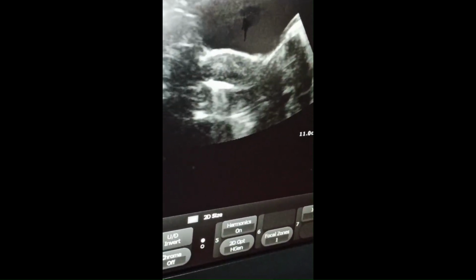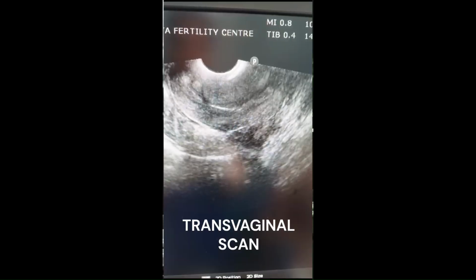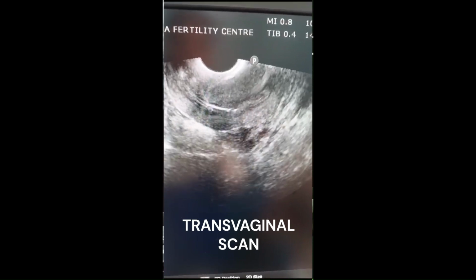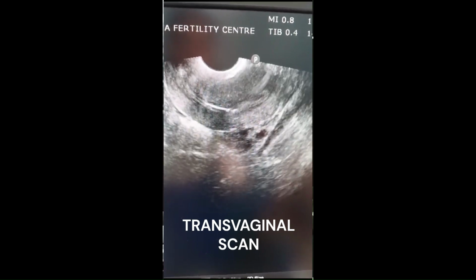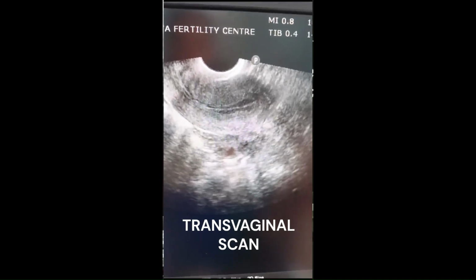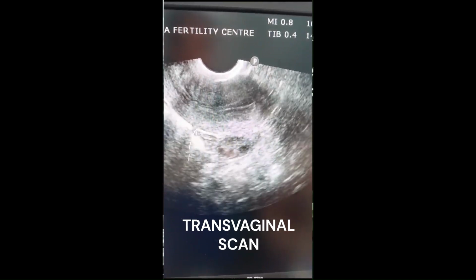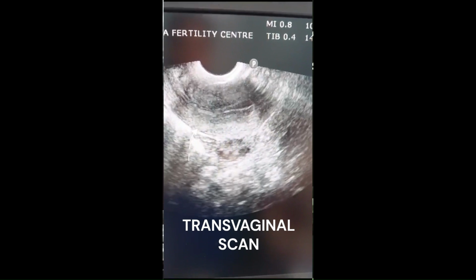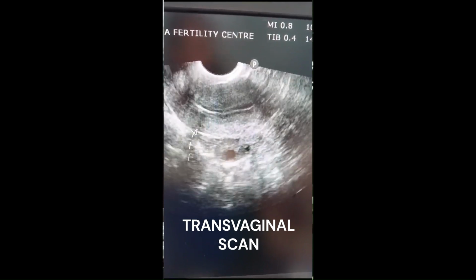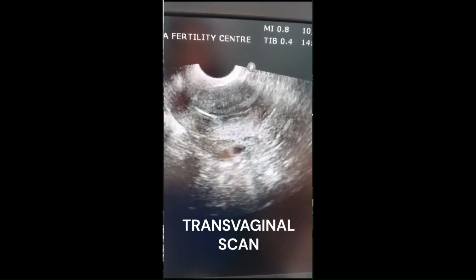In some patients, we see that they have a wide open cervical canal, also a patulous internal os. In such patients, straightening the uterine axis by doing a transabdominal guided intrauterine insemination will further increase the chances of the processed semen sample coming back into the cervical canal and into the vagina. Hence, in such patients, we would ask them to empty the bladder and do a transvaginal scan guided IUI.